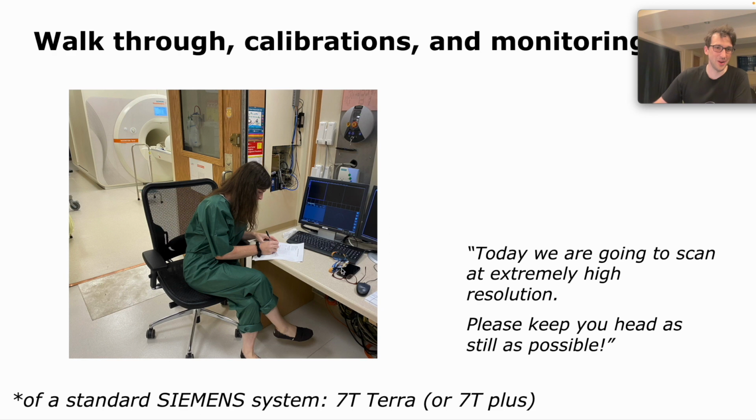So obviously you have your participants sign the consent form and make sure that they don't have any metal in or at their body. And one thing that I always say, at least for layer-dependent fMRI protocols, is if you're going to do high resolution, you need to keep your head as still as possible. Otherwise, we need to repeat some scans. So really keep them motivated, so that they don't move a lot.